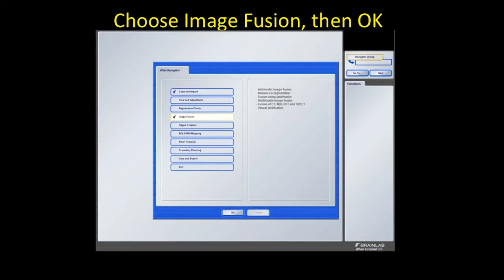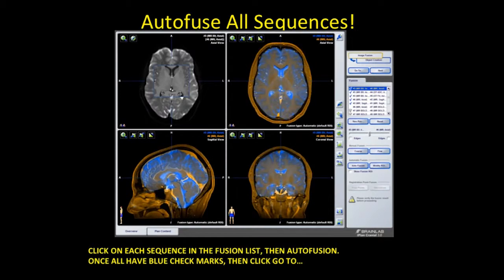Choose image fusion and then hit OK. You can now auto fuse all sequences. Click on each sequence in the fusion list and then auto fusion. Once all have blue check marks, click go to at the top.